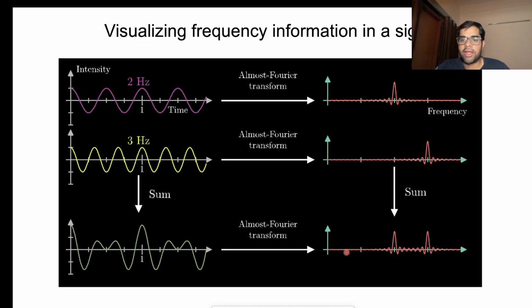Is it clear why we see the same signal in two domains, time and frequency? So the doubt is why are we moving to this. Yesterday we were discussing why we are moving to the frequency domain. So we do a lot of pre-processing steps, where there is a band pass filter and all.